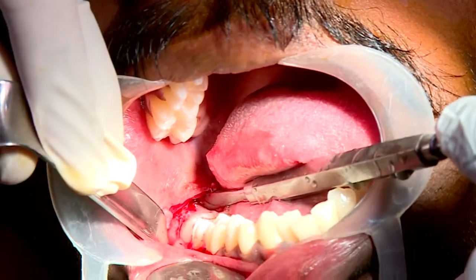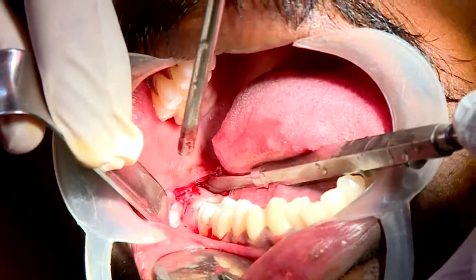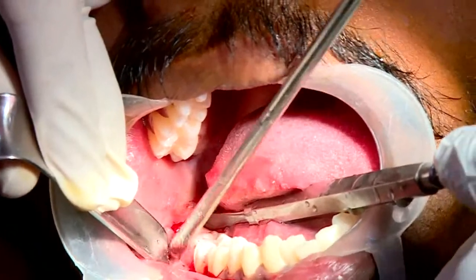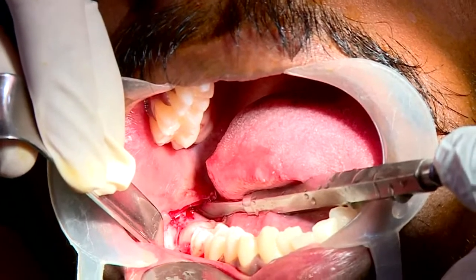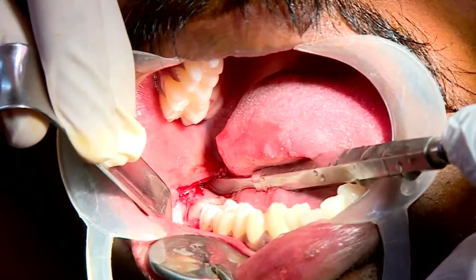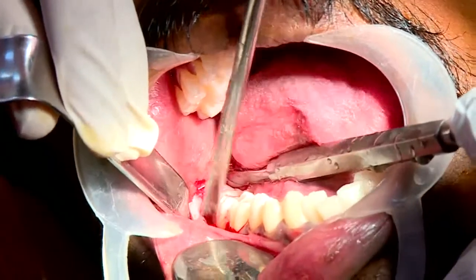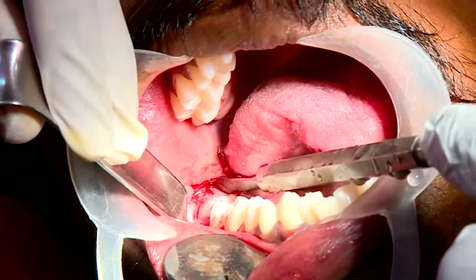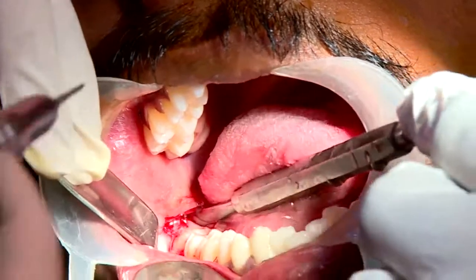Okay, so you are going to cut this, sir? Yeah, I'm going to start guttering. The guttering starts on the buccal aspect and slowly goes to the distal aspect. So sir is starting with the buccal gutter, forming a trough around the tooth. He will be creating a trough buccally and also distally.